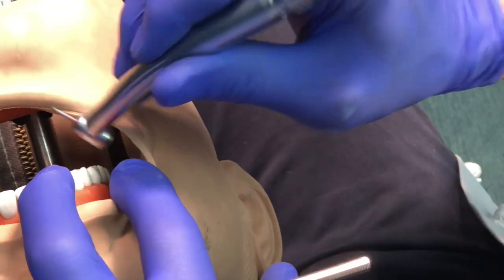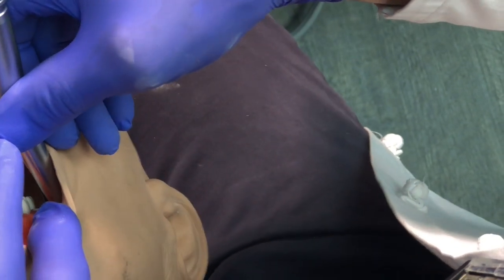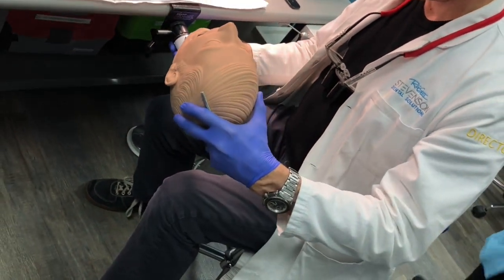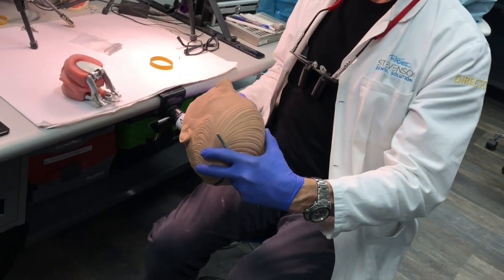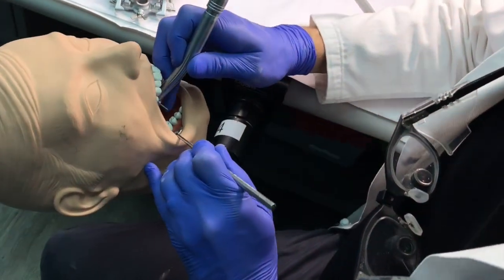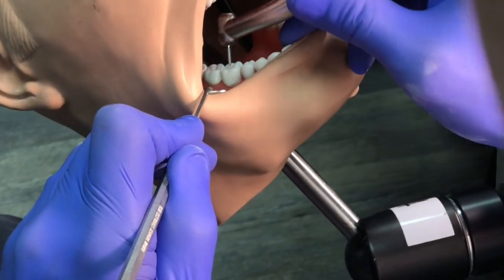I'm working at 11 o'clock, retracting, and I can work on the second and third molar. I can place a little finger rest on the molar — borrowing it from the other hand. When would I use the mannequin at seven o'clock? I loosen the rod, put it in the slot, tighten it, and now from seven o'clock I have an amazing direct vision view. Keep your elbows down — I can line up the bur right on the first molar very easily.